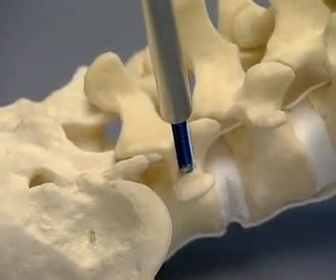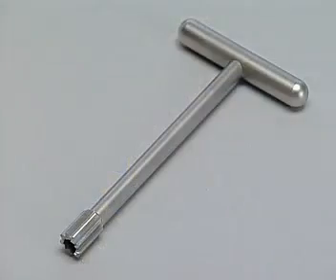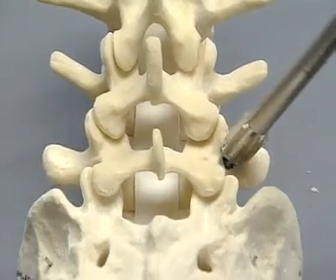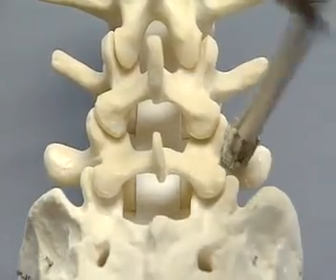The screw is not fully inserted — in other words, a few millimeters are left between the screw head and the bone. The reamer for the Cliquex is now placed over the screw head and the bone is removed. The reamer is angled 25 degrees in all directions, ensuring good clearance of bone to allow the Cliquex 3D head to be attached to the pedicle screw.